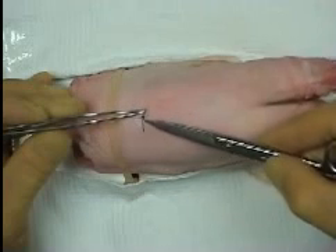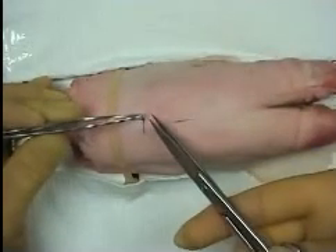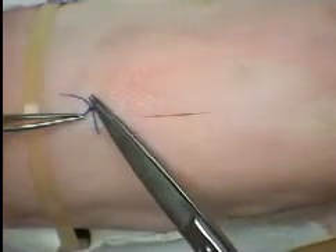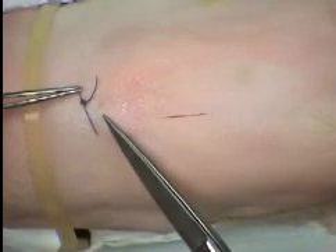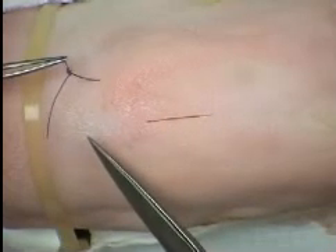When removing a suture, it is important to remember that the section of suture that has been sitting on the skin surface is potentially infected. This section should not therefore be passed through the tissues as the suture is removed. The suture is divided just below the knot and the tail pulled so that the external part of the suture does not pass through the tissues.